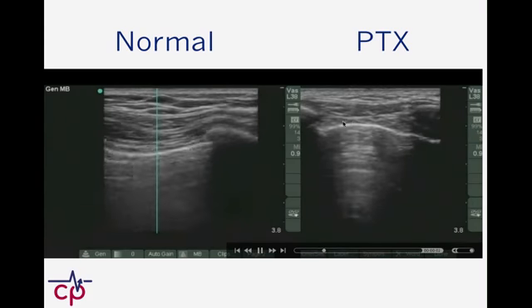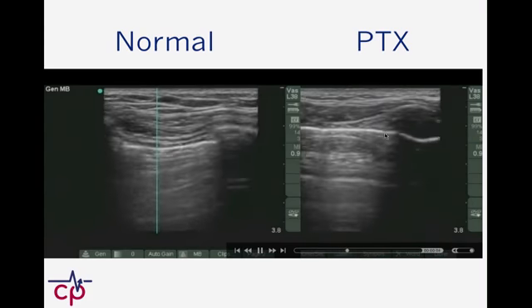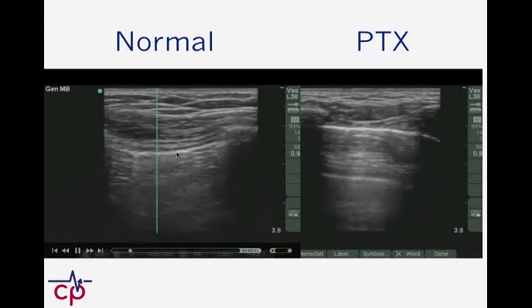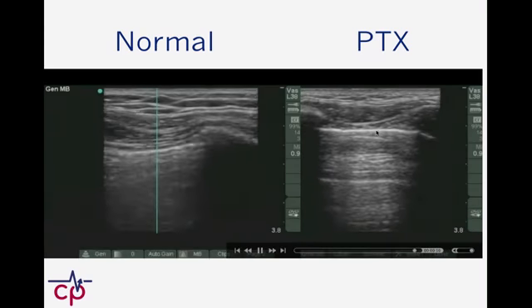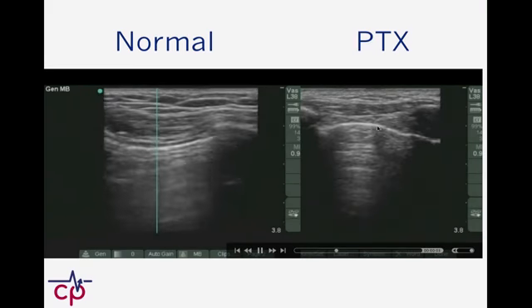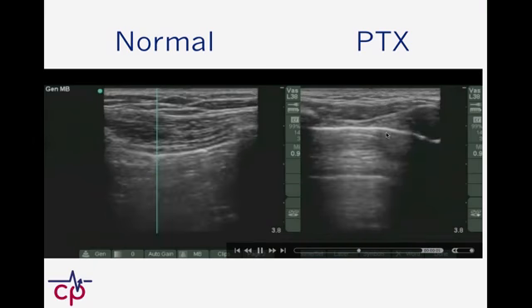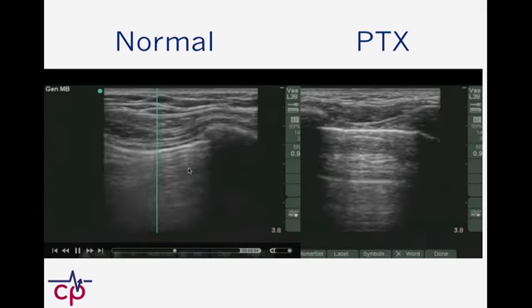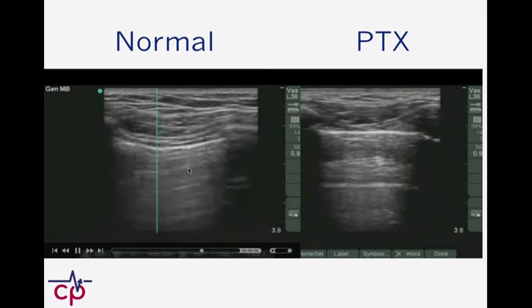I had this guy take a bunch of really terribly deep breaths, and you can see his chest wall bowing tremendously as he's doing that. Of course, I didn't have him do it when I was scanning this side because I didn't need to, but I just wanted to demonstrate that this guy has no sliding of his lung here at all. We don't see any of this bright white line here showing any artifact that looks anything like what we have on this side. And again, I think this is why it's important to scan both sides to compare.